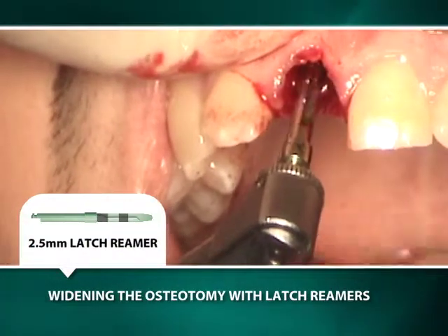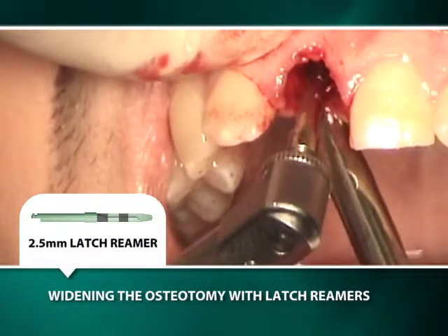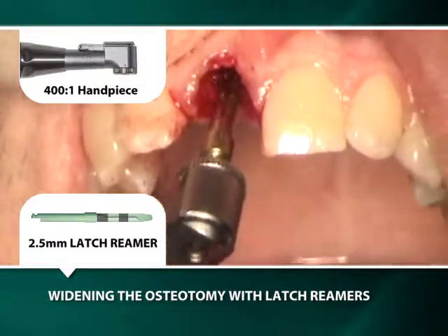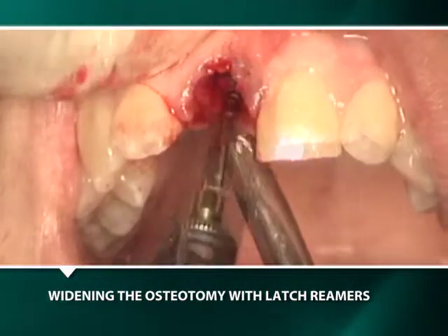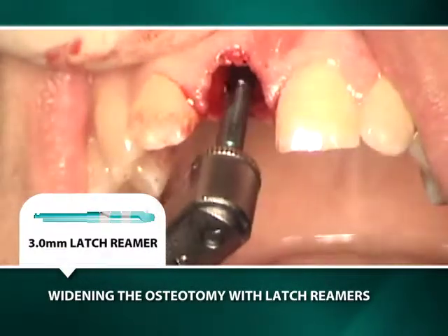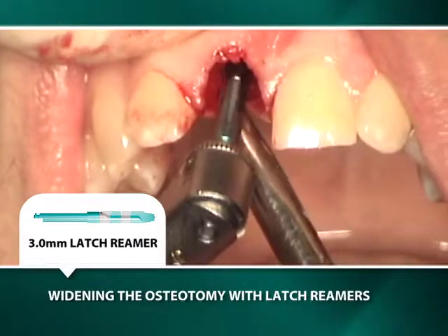The osteotomy is widened with the use of latch reamers attached to a 400 to 1 handpiece. Beginning at 2.5-millimeter diameter, the osteotomy is widened in half-millimeter increments using subsequently wider latch reamers rotating at 50 RPMs without irrigation.